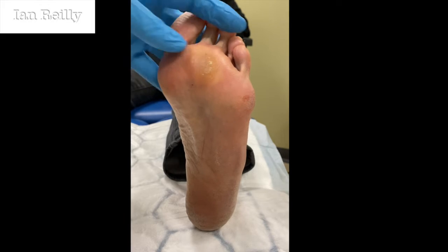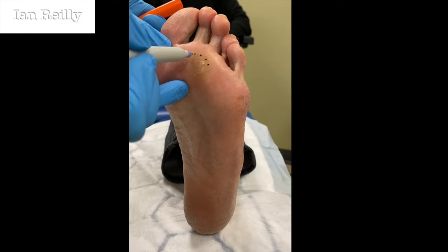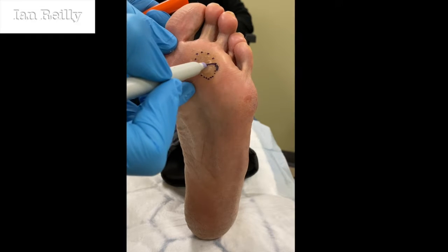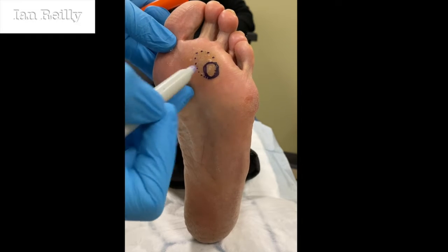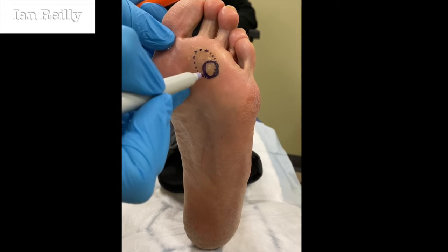In terms of location, we're going to take some callus off. We're not going to needle the whole thing because you end up with quite a big lesion. My partner in crime Belinda — we do needling courses together — we would often say you just need to really needle an area of it, so I don't want to give you a big sore area.